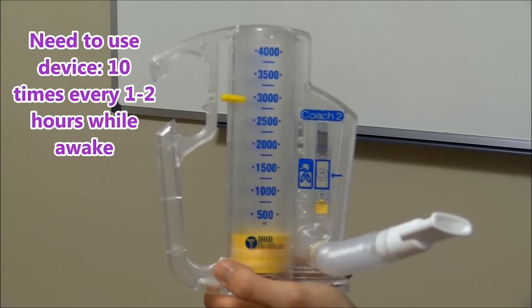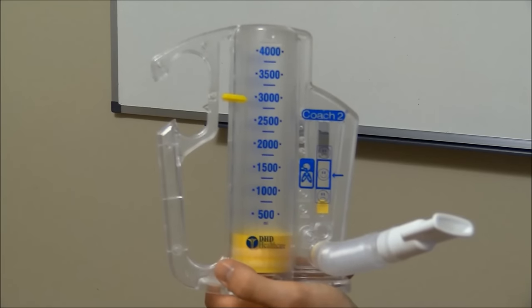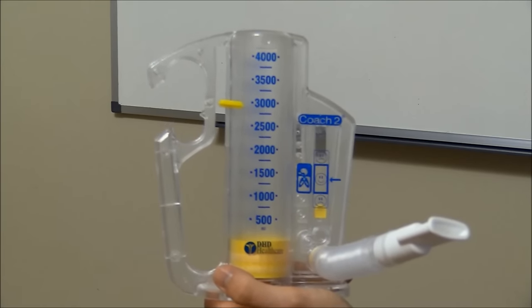And they will perform this at least 10 times every hour or two while awake. So this is what it looks like in action.